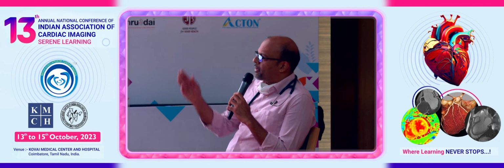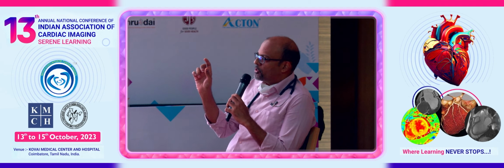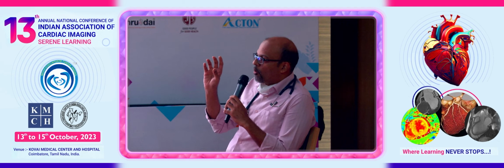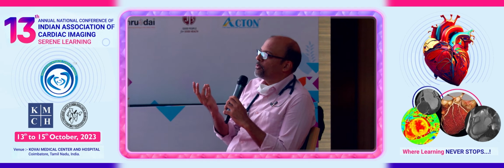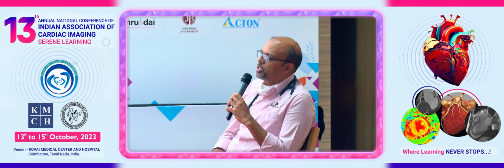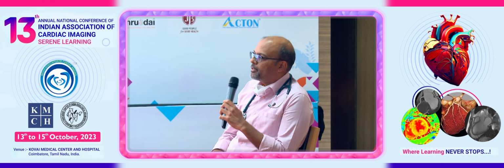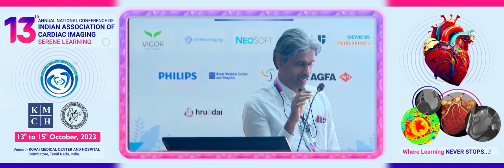So coming to the MRI criteria, you've given the risk factors. So you've written LGE, which shows fibrosis. So is there any quantity of fibrosis, like an amount or percentage of myocardial mass which should be fibrosis, which is a risk factor, or even if there's only a small amount of fibrosis, would you tell it's a risk factor for sudden cardiac death? Yeah. That's a very, very important thing which clinicians have to understand.